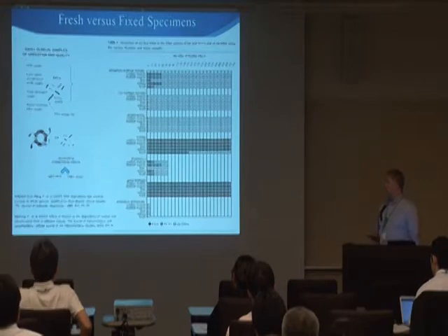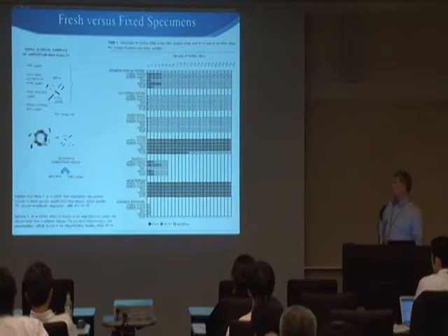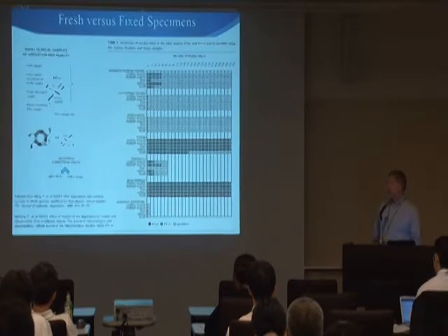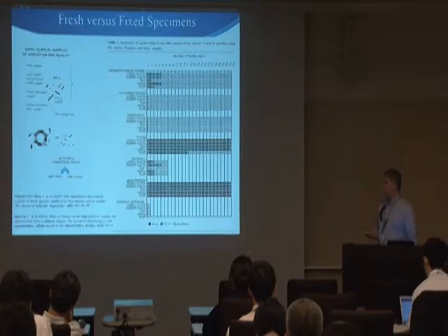And so one of the big considerations we had, and this was before the official release of the OncoScan platform to the public where you could actually run it in the lab, was that we knew Affymetrix was developing this platform for use with formalin-fixed paraffin-embedded specimens, and we wanted to test all the different microarray platforms and their applicability with samples that had been fixed in methanol acetic acid. At the time, I had phoned around to a bunch of different laboratories and asked how many labs had actually taken their cytogenetic pellets and hybridized them to array, and whether they had any problems with that. Nobody had really done a lot of work with this, so we thought, well, we better give it a try and see if it works.